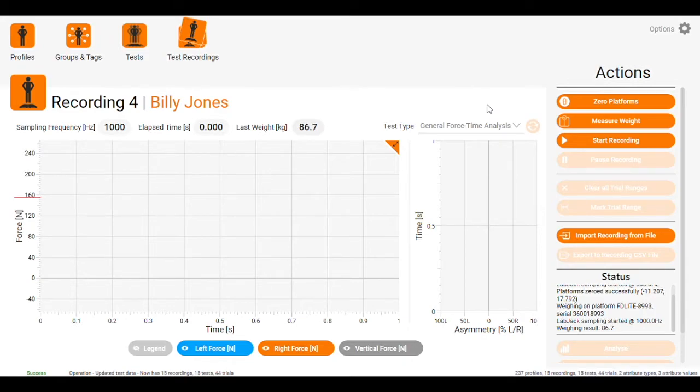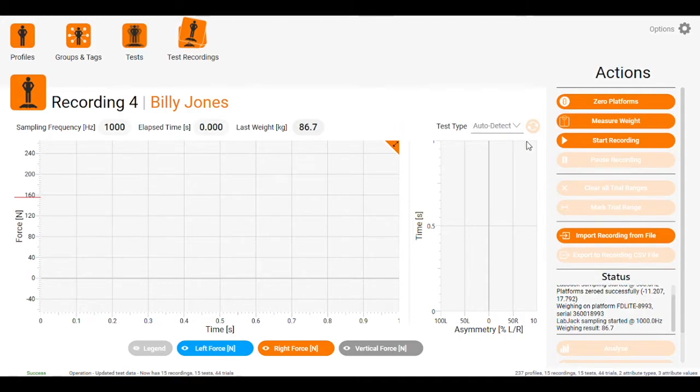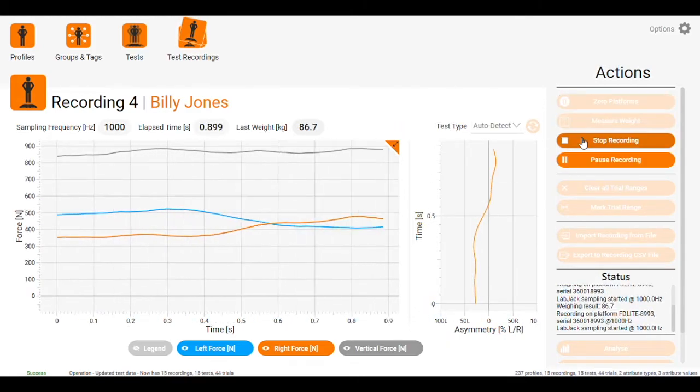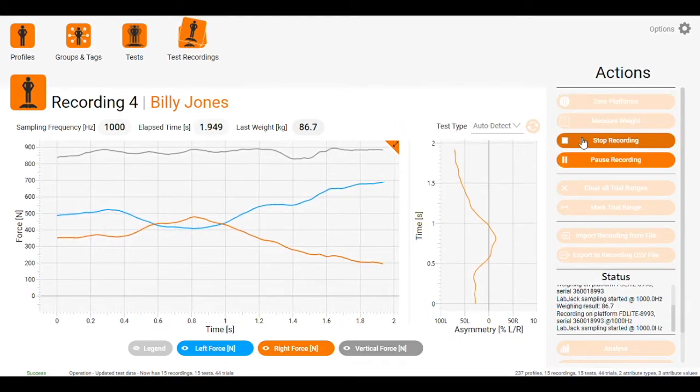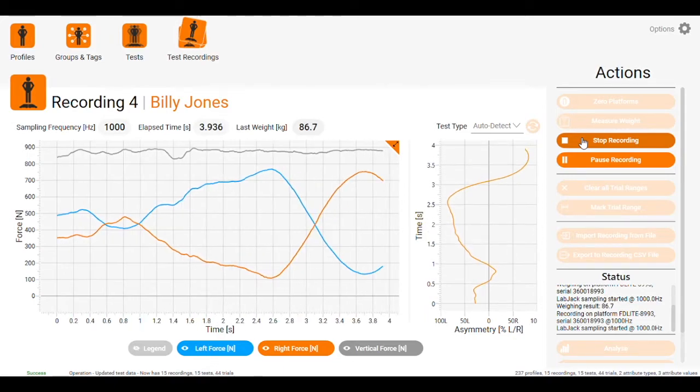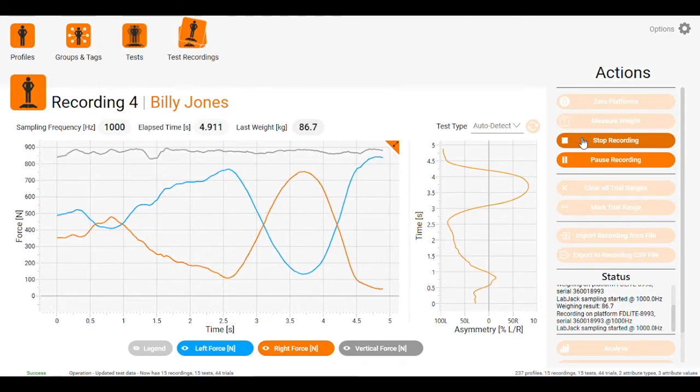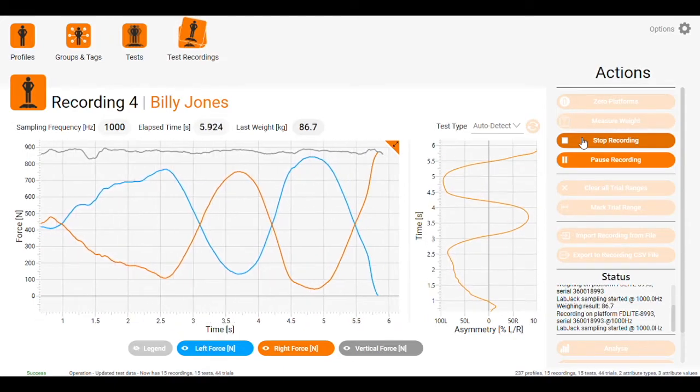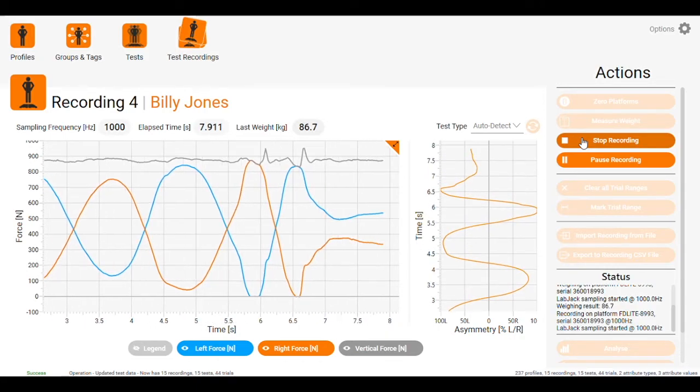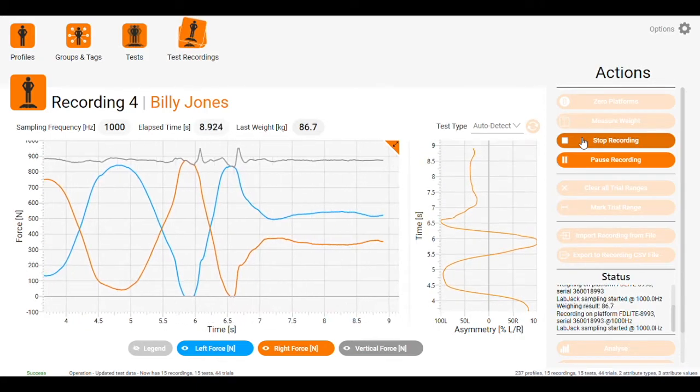From there, we go in and choose whatever type we want, then start recording. As we can see, the plates are now live. If we put more weight over one side or the other, we get a movement in the curve.